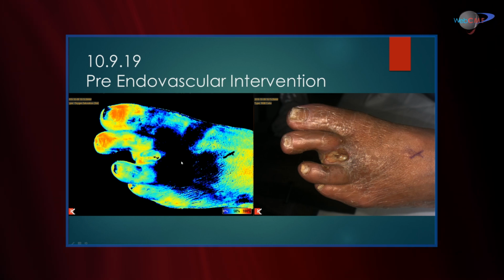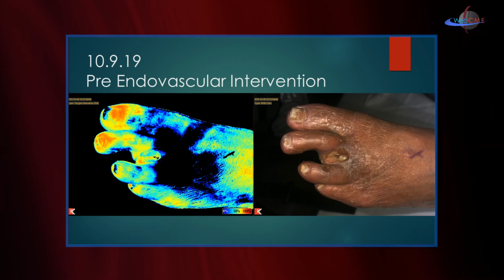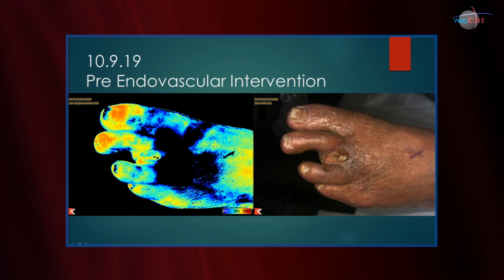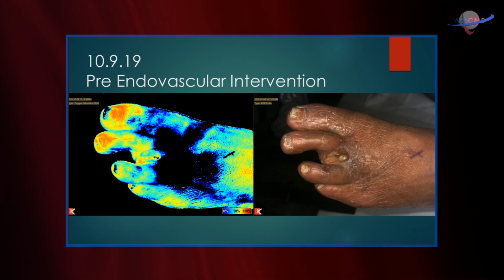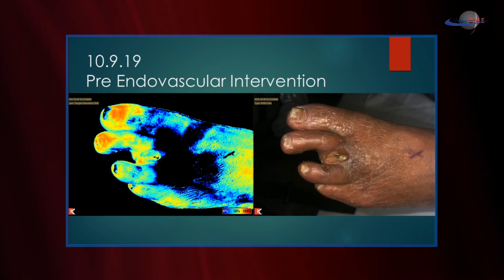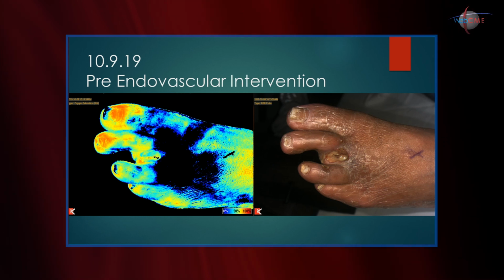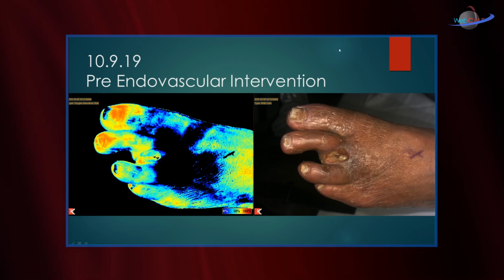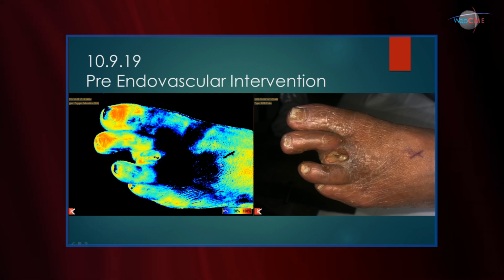Jonathan, I'm assuming that everything blue is deoxygenated and correlates with poor tissue perfusion. That is correct. This patient here is a little bit difficult to photograph, for instance. There is that large black area in the middle of the foot. That isn't because that area is deoxygenated. It's simply because of the way this camera works with light reflection, any shiny surfaces, and you can see on the full color image, won't reflect light well. But nonetheless, we want to see everything bright yellow and red, which indicates good oxygenation. Everything that is not, is not well oxygenated, correct? That is correct. All right.